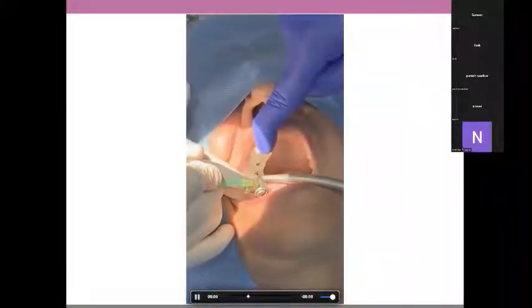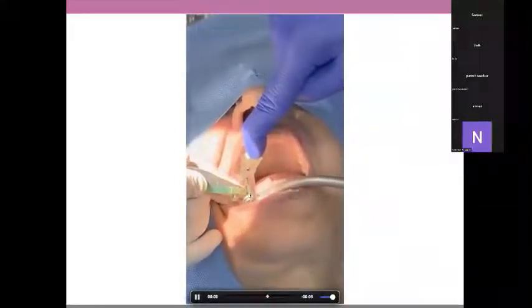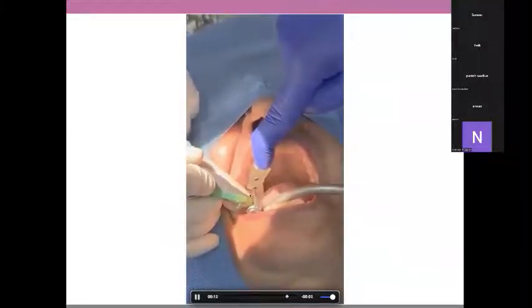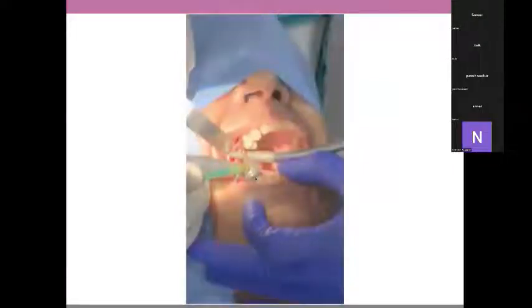Now here I planned for an indirect sinus lift. So you see I've taken a shorter drill, which will be 1 millimeter short of the sinus. So this is not a fully guided procedure, but yes, this will give me my pilot holes, because then we had a little different plan. I had to expand bone and do an indirect sinus lift. So this is not a fully guided procedure, but yes, this is more or less a guided procedure.